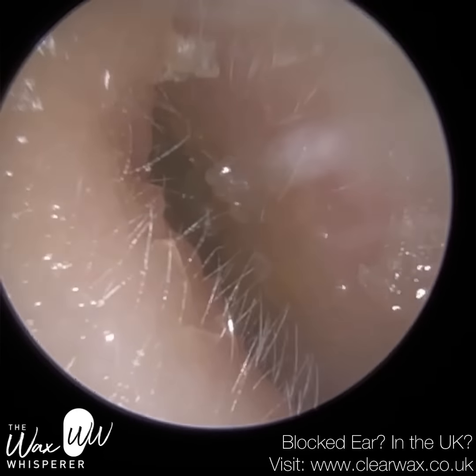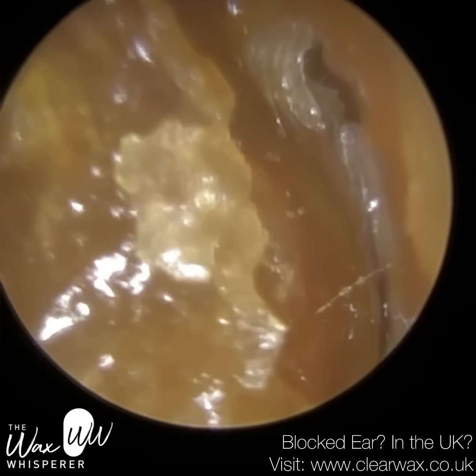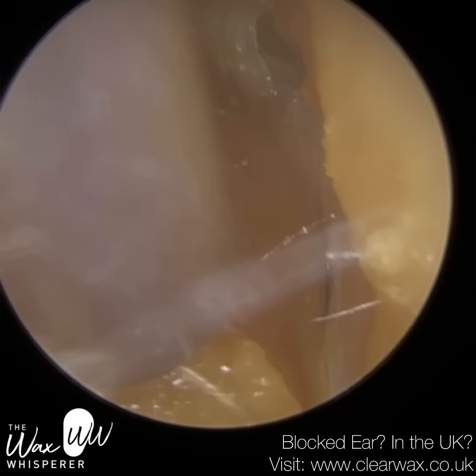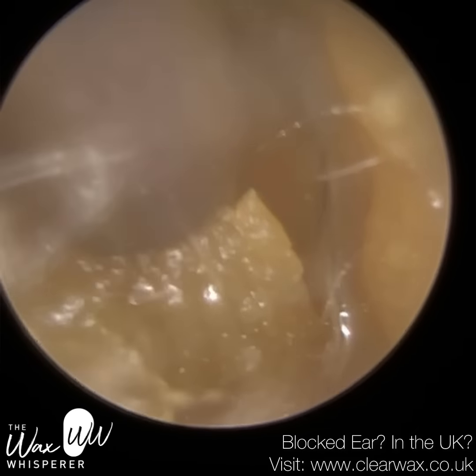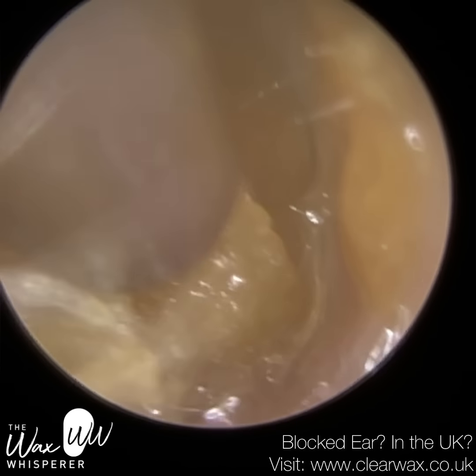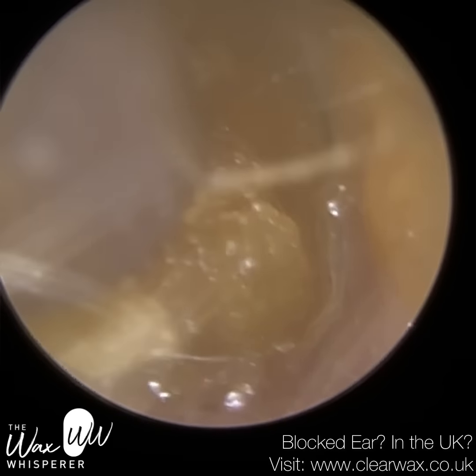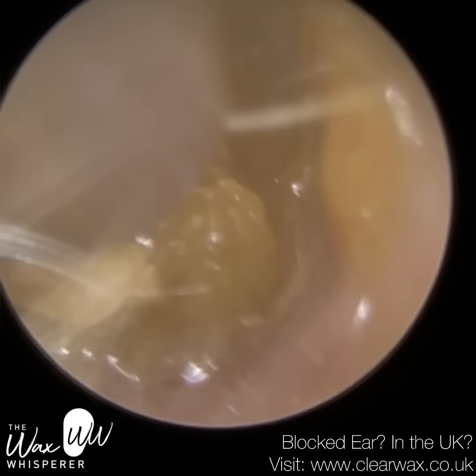It wasn't a central perf. It was more to the posterior region. So possibly because of the location, it's got a bit more blood supply. It's had a chance to heal. The middle layer is also potentially healed, but I will upload that video.